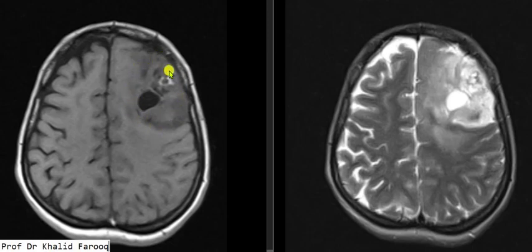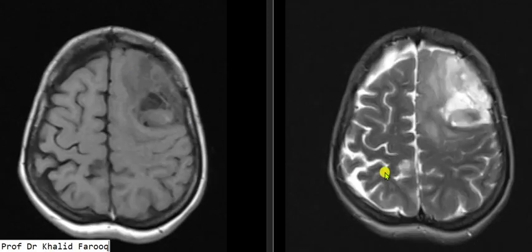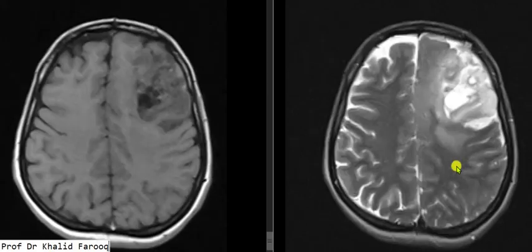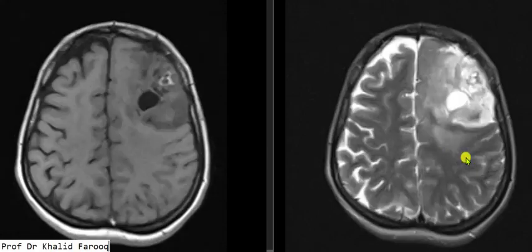The mass lesion involves the left frontal lobe anteriorly, involving the cortical gray matter and adjacent underlying white matter, with mass effect on the brain parenchyma. There is also a mild degree of vasogenic edema.